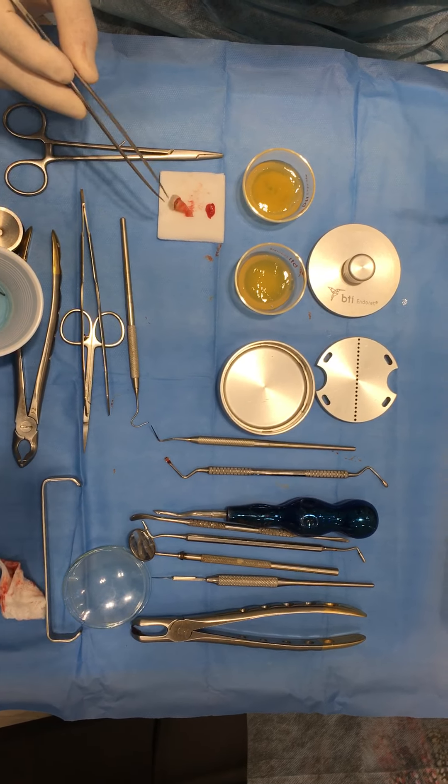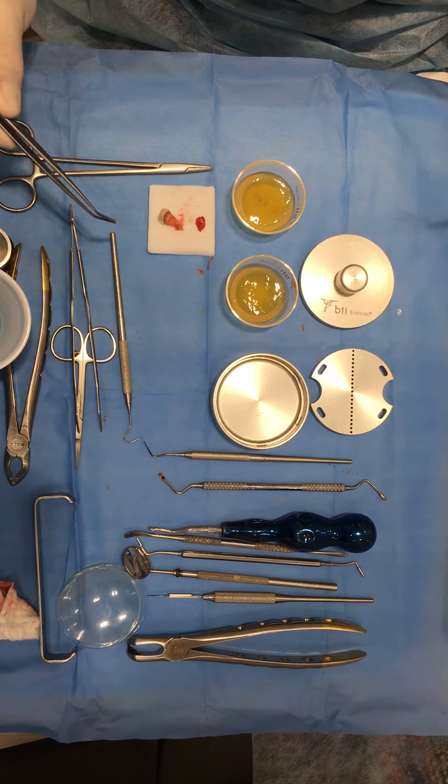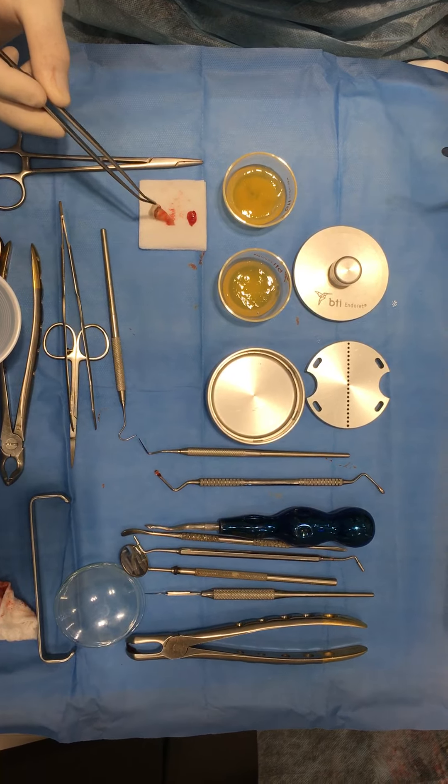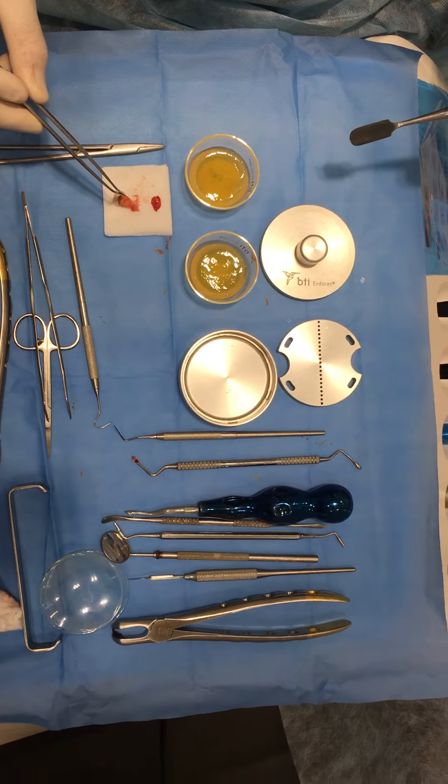Here we have the case — this is the extraction that we did. This is a lower left second molar that developed this cyst and abscess due to an endoperiapical lesion.